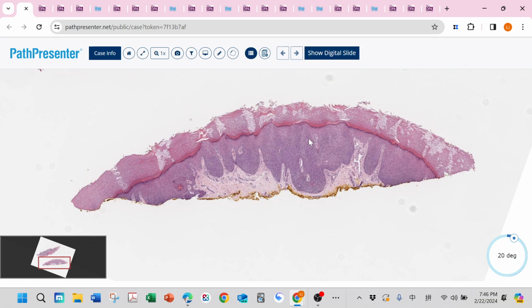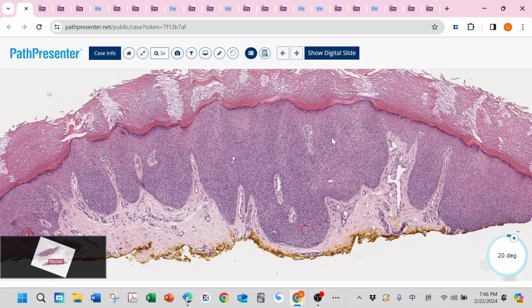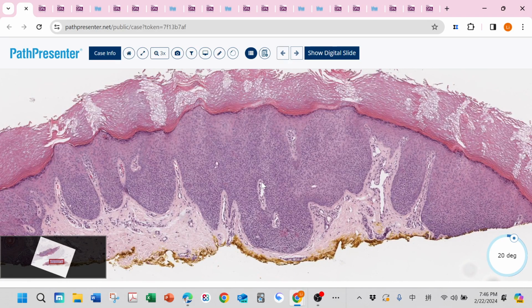it sometimes really looks like seborrheic keratosis, because we can see this epidermis with acanthosis, thickening of the epidermis. You may also even see this pseudohorn cyst structure, but some structures are usually not seen in seborrheic keratosis. That is what we call the poroma stroma. It is a hyalinizing stroma with these dilated blood vessels. So this is really characteristic for poroma.